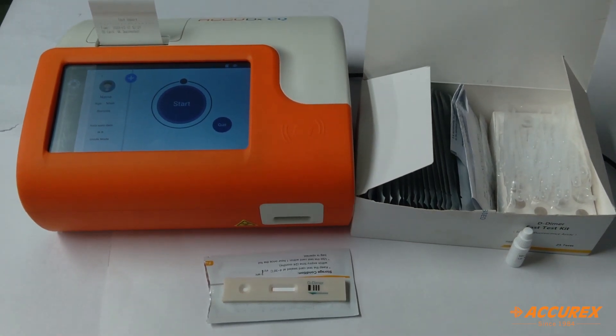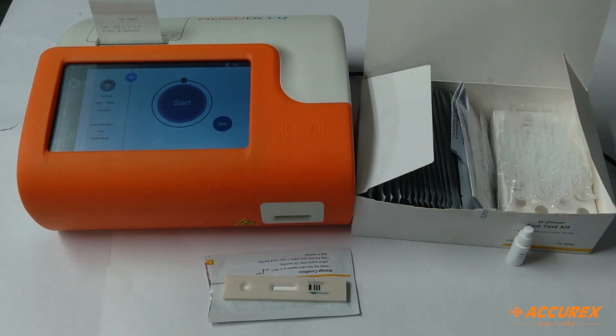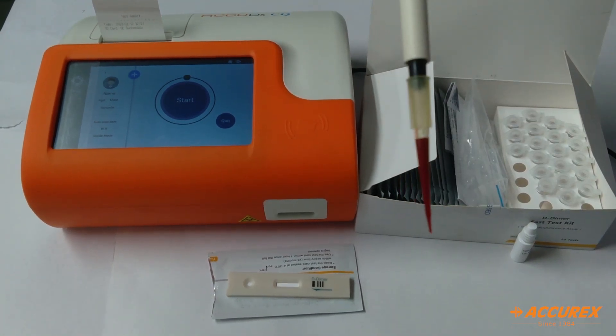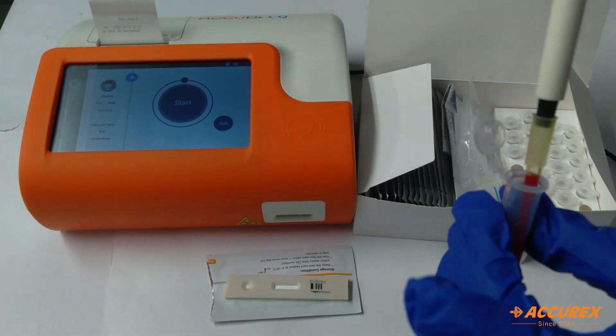Now we'll add the sample in the slot given over here. According to the pack insert, we have to add 100 µL of sample. I have taken 100 µL of whole blood sample and I'll add that into this diluent.